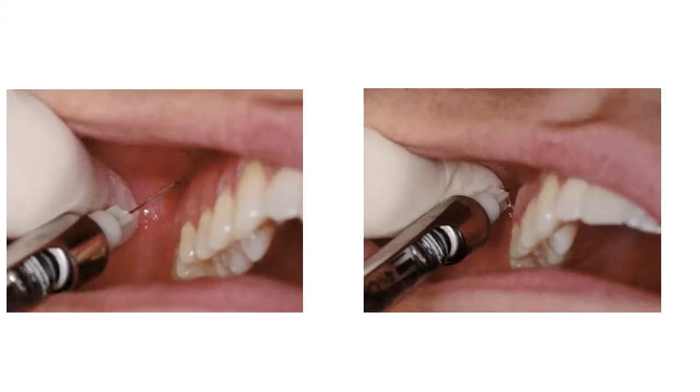These are the clinical photographs depicting the procedure involving the posterior superior alveolar nerve block.